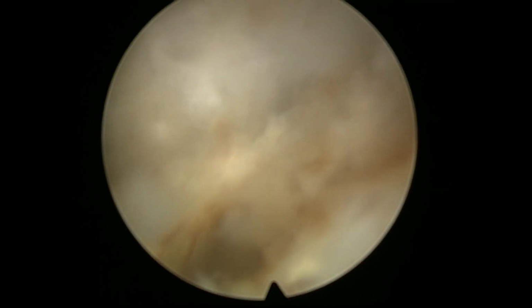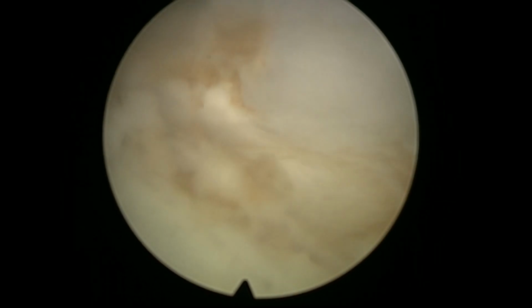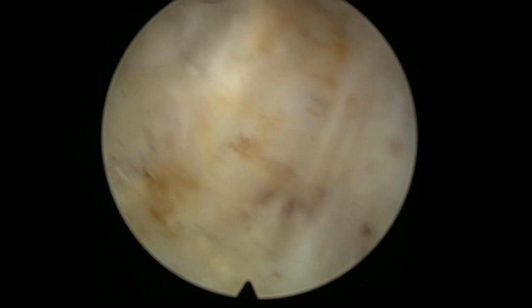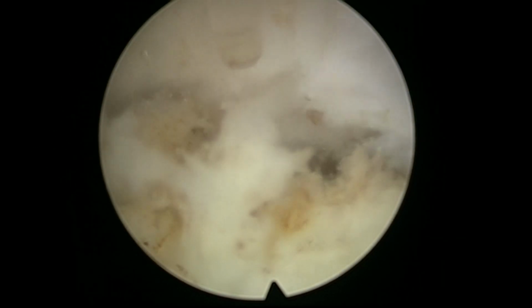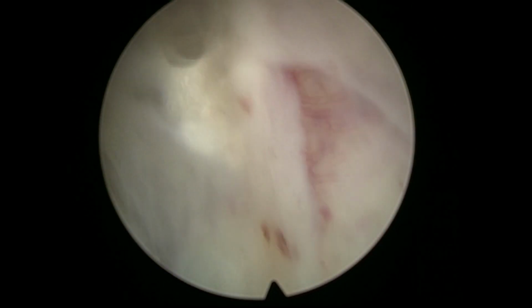And I have to say that we see these cases in Bulgaria where probably the primary care healthcare system is not very developed, and patients go to the doctor when they have bad symptoms, retention, things like this. So we see sometimes very advanced cases with very high PSAs, and even sometimes in patients who do not have access to drugs for the hormonal treatment of prostate cancer, we can do a simultaneous endoscopic enucleation of the prostate and a surgical castration at the same time. So, which is an option for these patients in this setting.